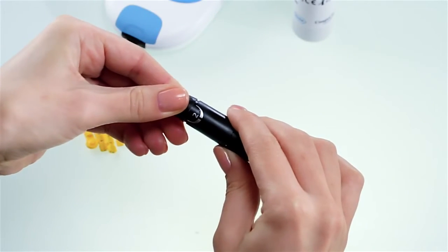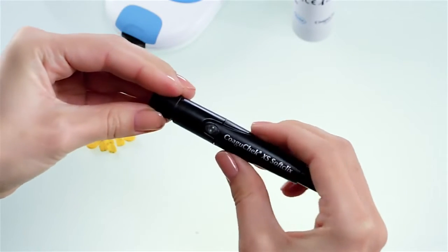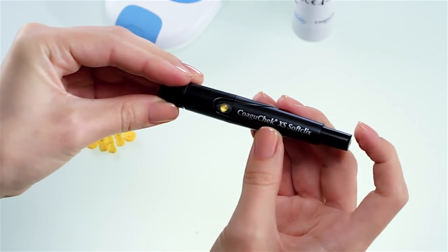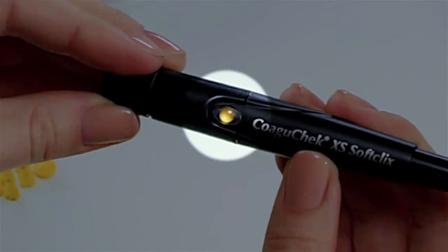Prepare the lancing device by inserting a fresh lancet. Prime the lancing device by pushing the plunger all the way down. The release button on the side of the lancing device has now turned yellow, indicating that the COAGUCHECK XS SoftClicks is primed and ready for use.